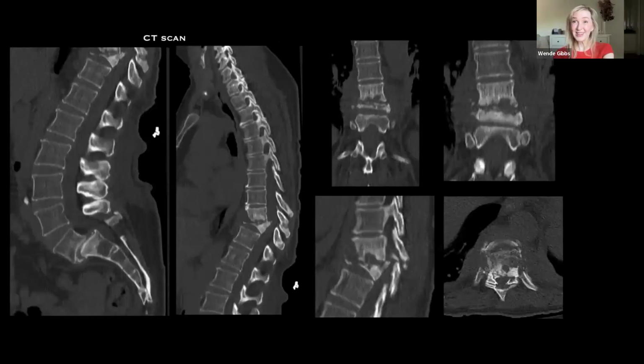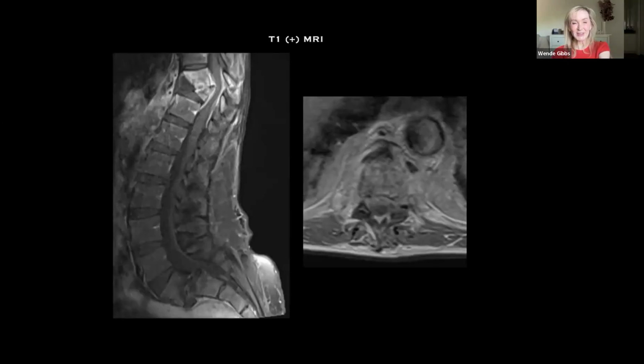And this is what the CT scan was. Can you go back for a second? That was the perfect example of how you know it's infected on that axial image: that paraspinal, prevertebral, paravertebral soft tissue. If there was any doubt, there's no doubt, but that is where you look when there is doubt.